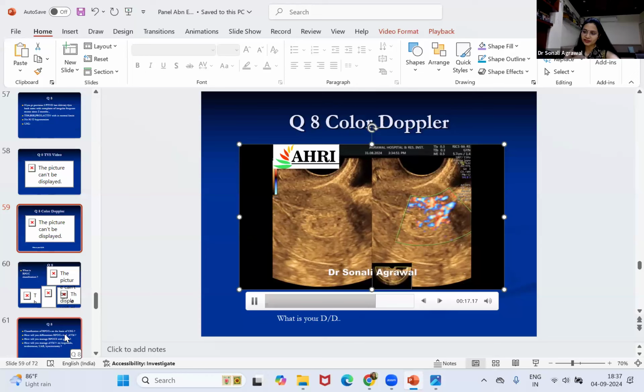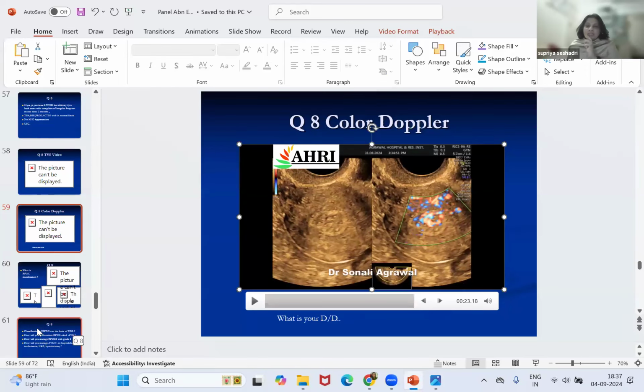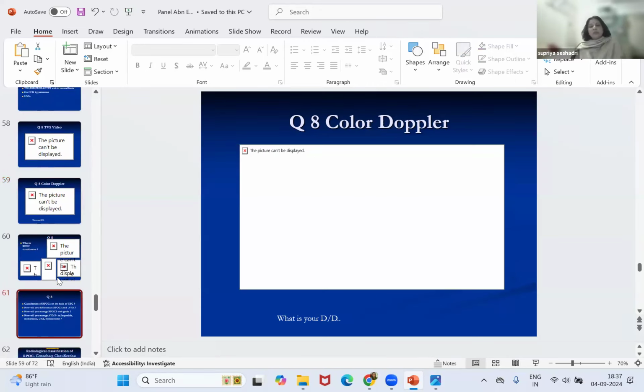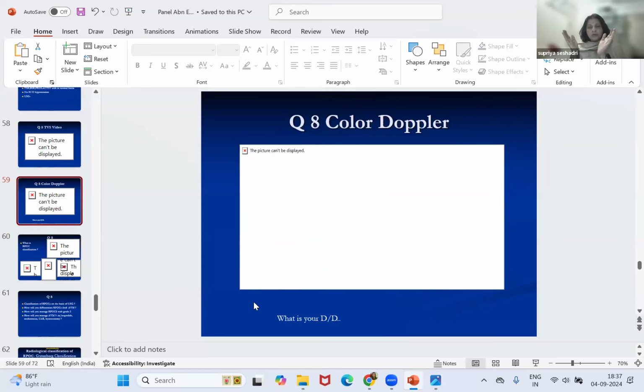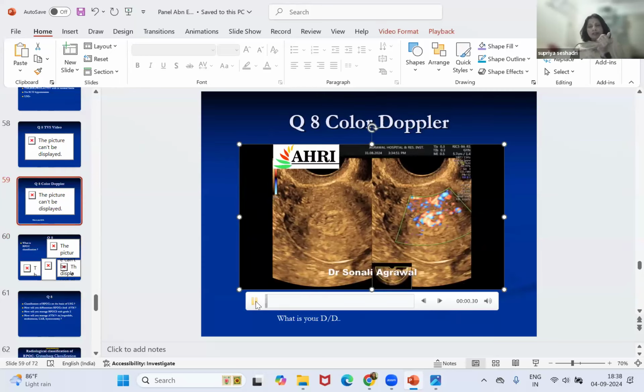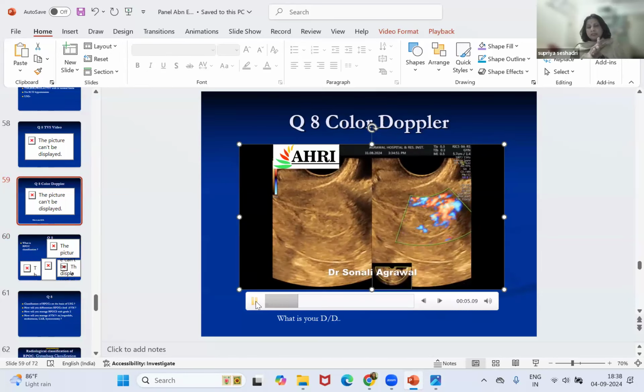Let's ask our expert today. Supriya ma'am. Okay, I'm just saying the classifications now. As far as ultrasound goes, in order to help management, there are 2 ways of looking at it. One is, here it's very obvious, against the history of taking MTP pills, it's a heterogeneous mass. This is what we call an endometrial mass. How do you define an endometrial mass? Anything that bulges the borders of the endometrium. So there is an endometrial mass, there is vascularity, against a background of pregnancy, yes, this is an RPOC.